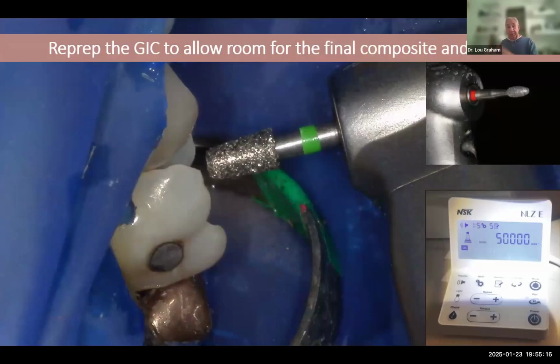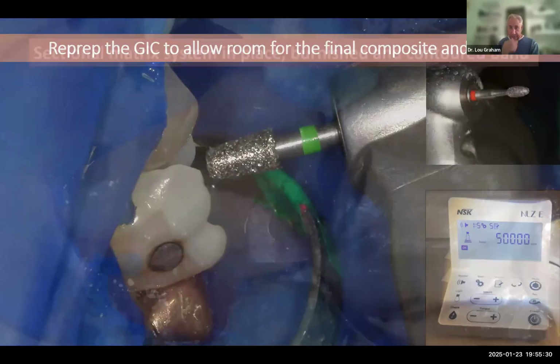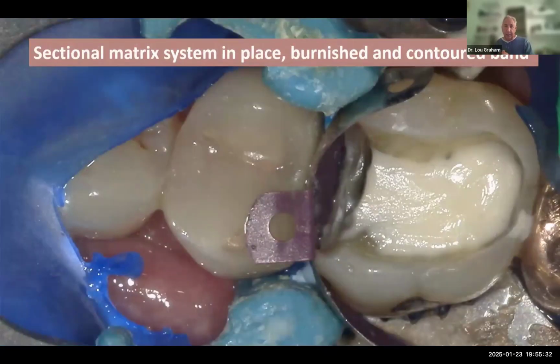So at the 2 minute and 30 second or the 4 minute mark, after it's set, I'm just going to re-prep the floor of the excess glass ionomer. I'm going to remove any glass ionomer on the walls. And this is what you see.